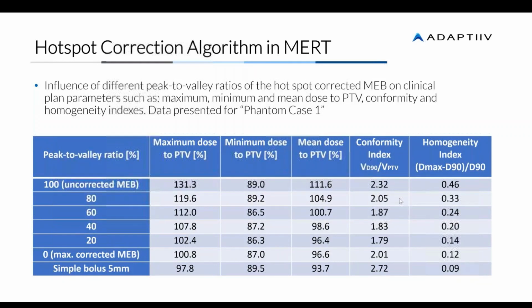We take the conformity that's been accomplished within the MEB, and we take the homogeneity, which is very comparable to the homogeneity of the simple bolus.